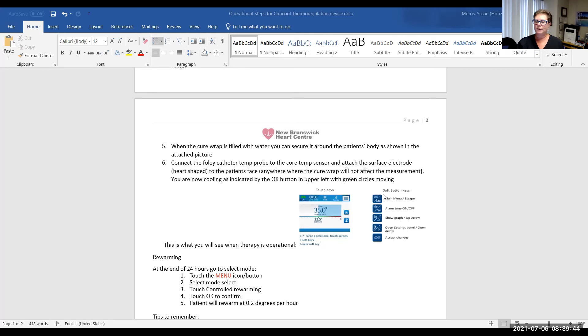There's soft buttons on the side. One says main menu. The next one is your silence alarm button. If you want to see the temperature graphs and you can do it over an hour, six hours or 12 hours, you can click it here. And anytime you make a change, here's your okay button.